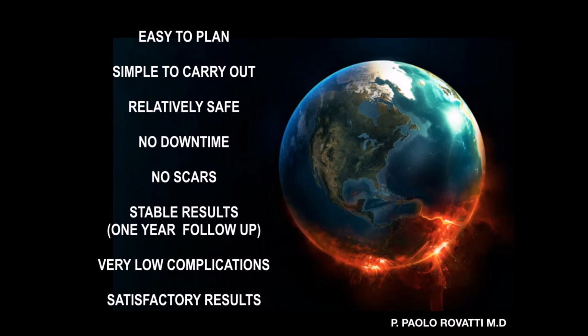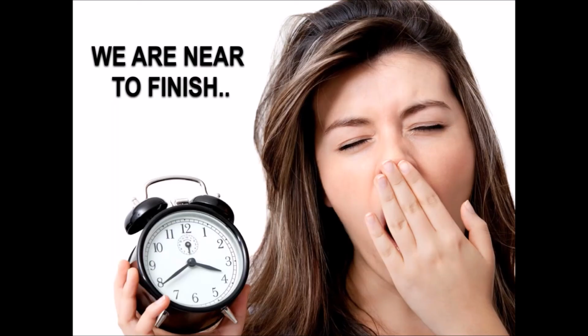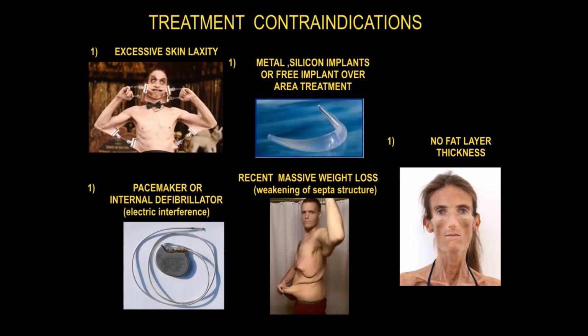Now we must speak about contraindications. If you have too much laxity of the skin, or if in some places where you are heating there are silicone implants or some metal implants, pay attention, you are heating, so we are damaging. So ask and do a good anamnesis with the patients. If they have a pacemaker or electric defibrillator, you can have interference because this is an electric device. Pay attention, ask everybody.